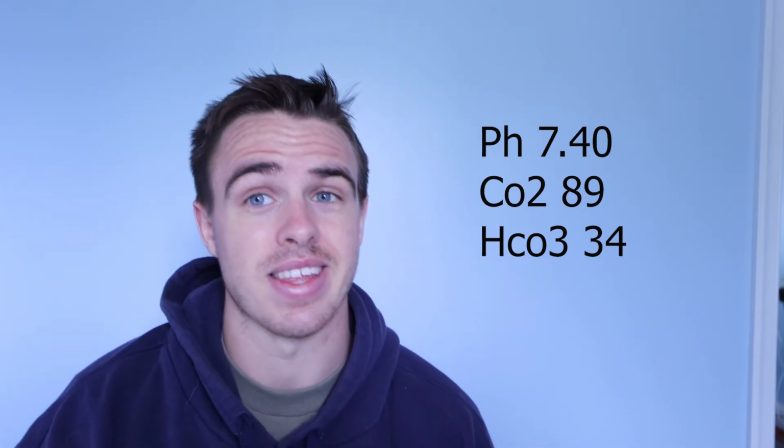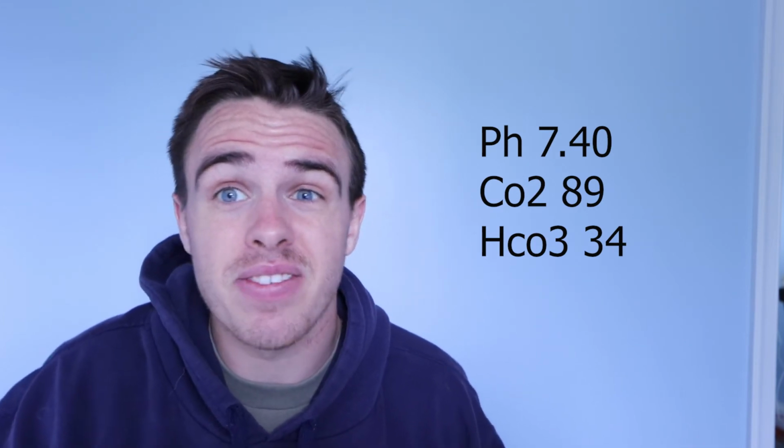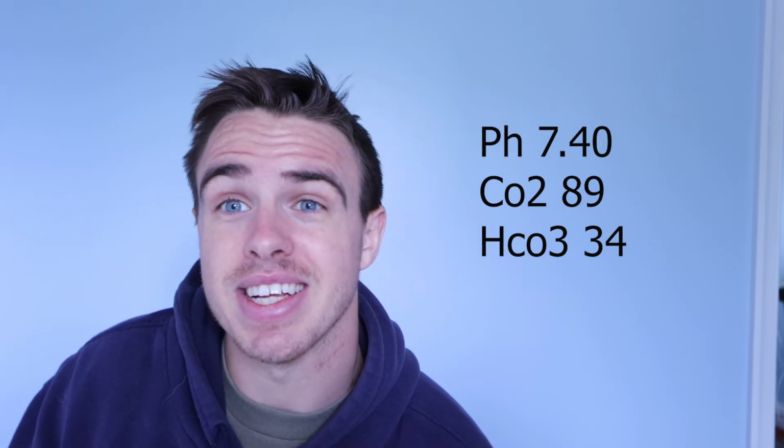So this is probably where this person lives, honestly. So this is probably like an extreme COPD, or someone who has it very badly and their body just got so compensated, fully compensated, that they just live at a very high CO2. And I have seen CO2s where people lived and they're almost in mid-70s. Now 89 is a bit high, but hey, I'm just making up some different ABGs here.